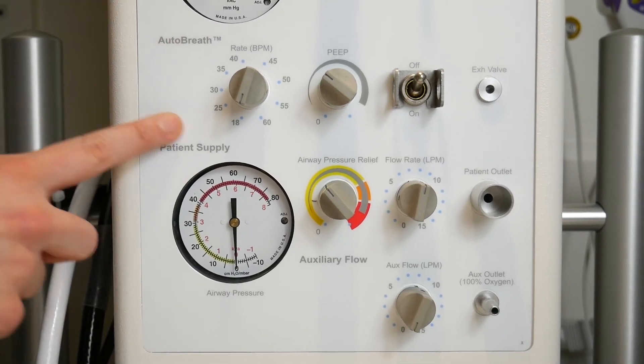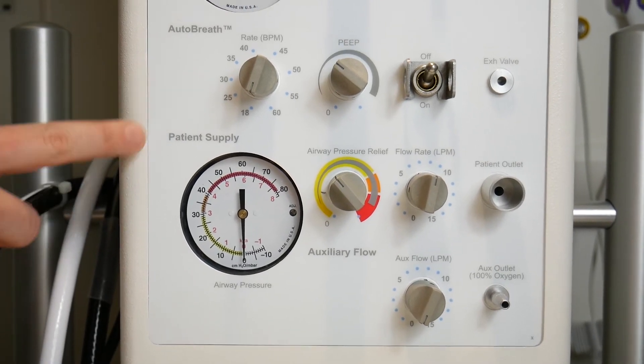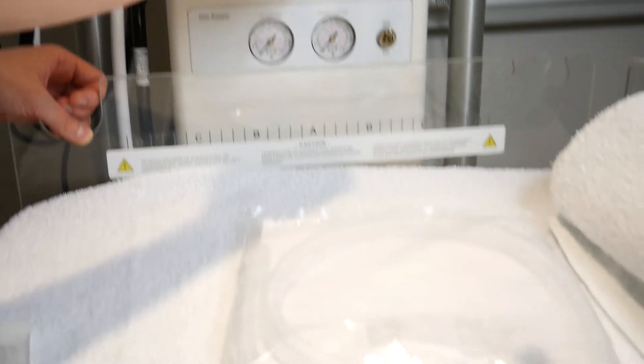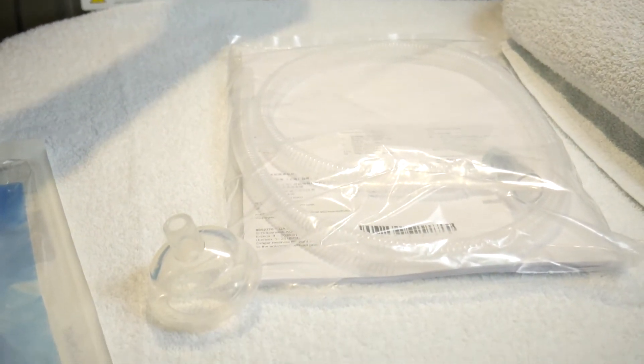This large panel corresponds to the ventilation settings. A T-piece can be attached to the auxiliary gas port here. You will have already set the FiO2 with the dial above.